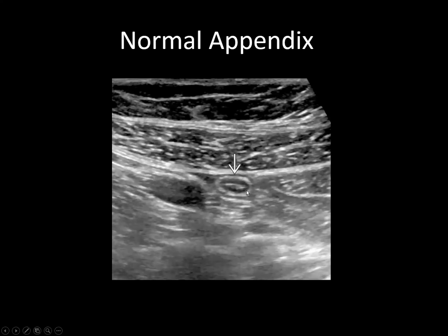This is a normal compressible appendix on transverse view. Again, you see the layers of the gut signature of the appendix.